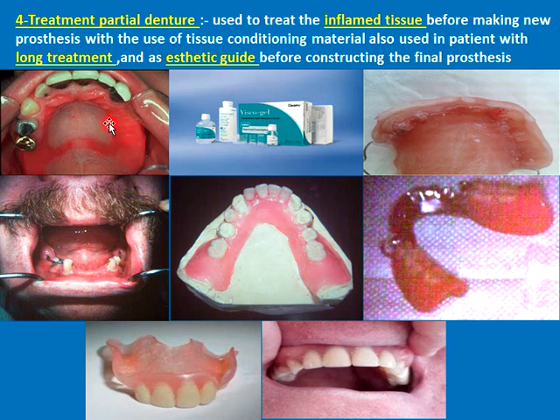So we use the same existing partial denture and we use what we call tissue conditioning material to be realigned with the denture، وعادة هاي تتبدل every 3-4 days until the tissue become normal. Then we construct البارشال الجديد. فإذا أول استخدامه in inflamed tissue.